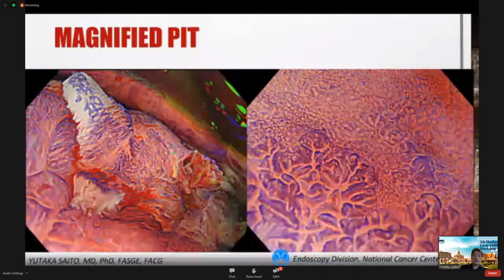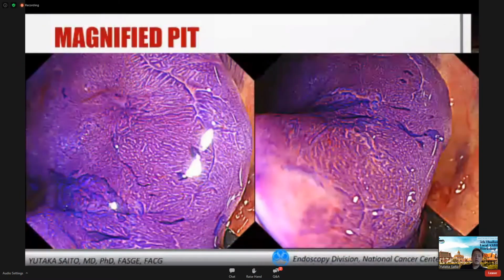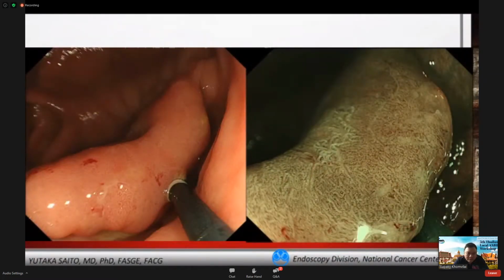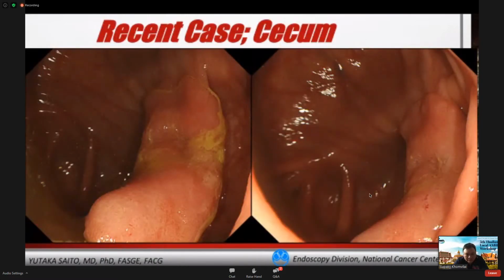So no Q&A slides, but Dr. Supakij, how do you diagnose this lesion? I think it is a non-invasive lesion. Yes, so I think I will go on with endoscopic resection, ESD, for this kind of lesion after the detail that you gave me. Yeah, but how about the conventional white light image? With the conventional image that you provided, it seems like there is an invasive part in the middle, with retraction in the center. Oh, Dr. Supakij has an eagle eye.